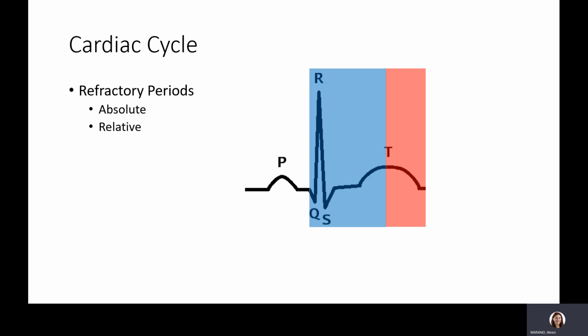Now, it can be a little dangerous if we're at this time. We want to make sure that the heart is getting its full resting phase, and if it does have stimulus at this time, you could also have the R on T complex, which can be dangerous.